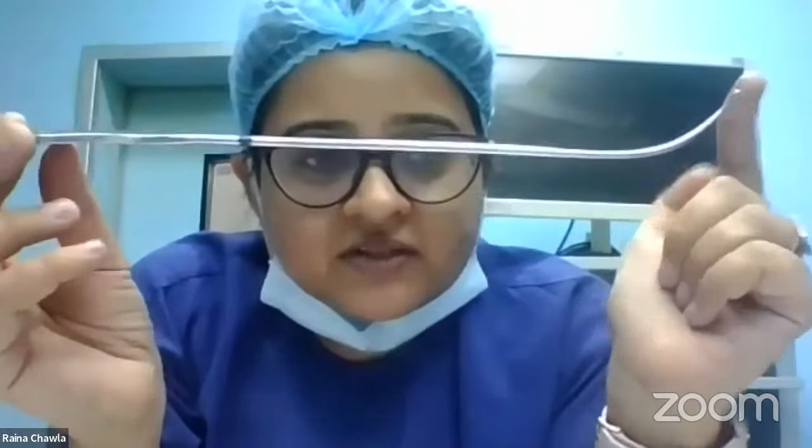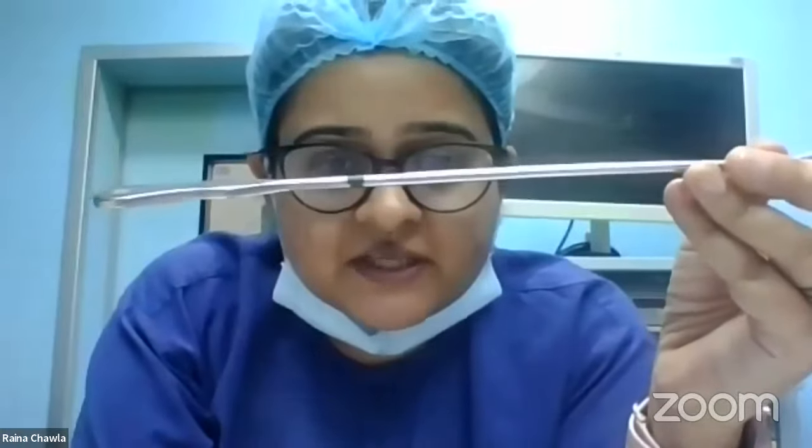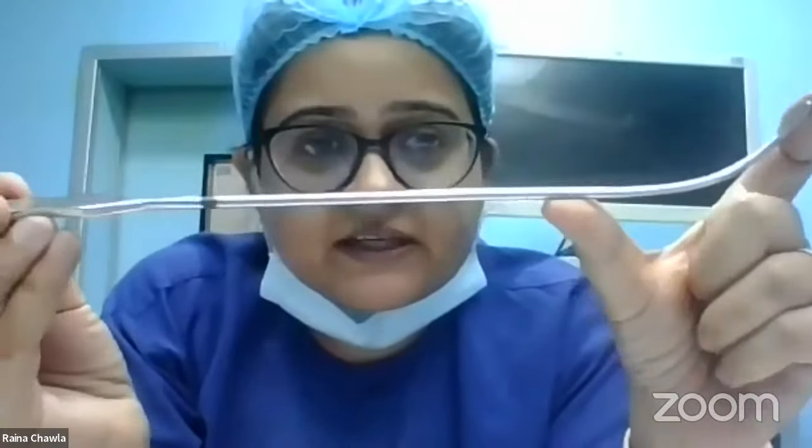It also, if you look carefully, I'm not sure it's visible here, but it has gradations. Okay, centimeters on one side, inches on the other side. Okay, so a sound, when you hear the word sound, that is uterine sound or bladder sound, it is basically used to sound that organ or measure that organ. So that is why we use a uterine sound: to measure the length of the uterus.